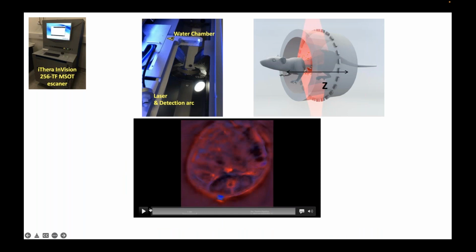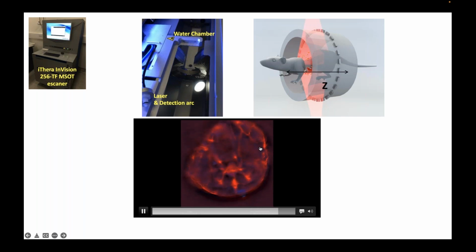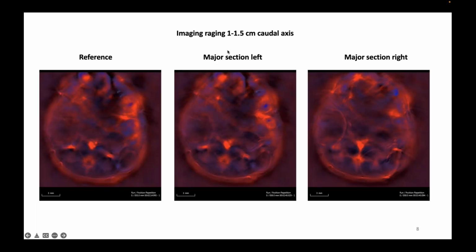One thing that I think is important in our experimental design was that we were taking several sections along the caudal axis. I wanted to have the whole tumor together, although as you will see, I didn't use all this information. I was taking around 1.5 centimeters because I always wanted to have first an anatomical reference that was always the same, this one that I'm showing here. So I was using as a reference of the oxygenation the aorta and the cava vein.